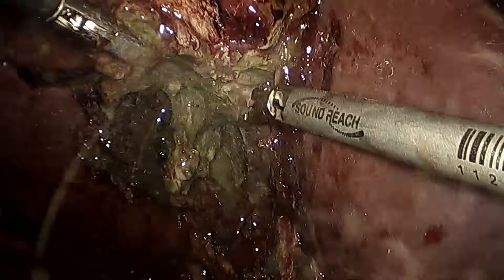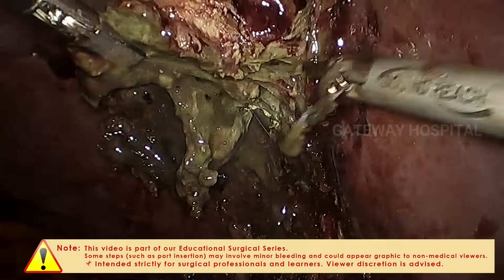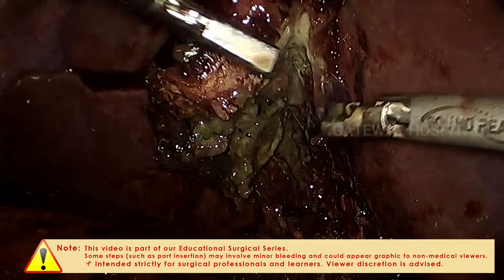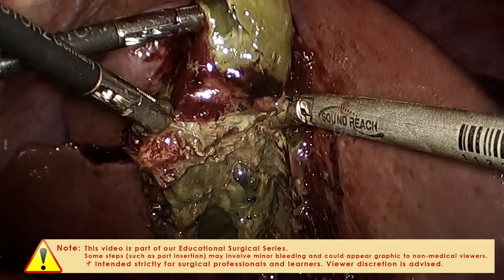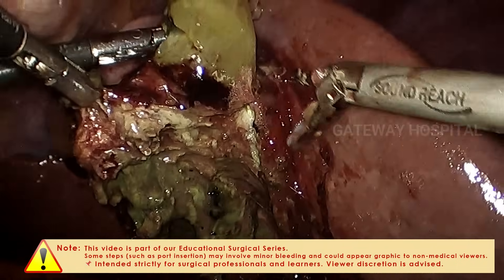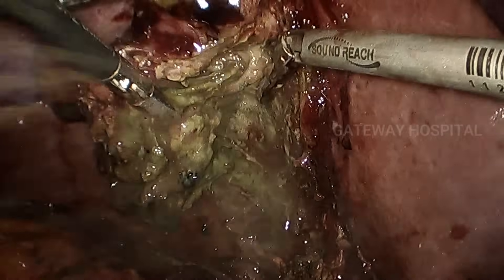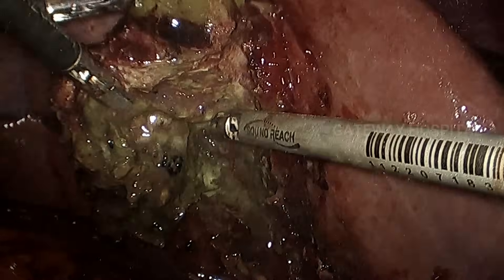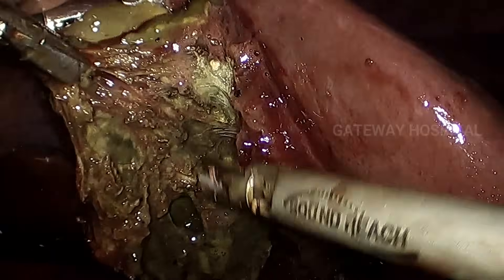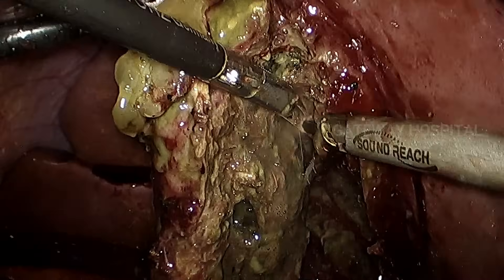Even in these difficult cases we will be able to find a good plane and can easily separate the gallbladder without any bleeding. The remaining steps are similar to standard laparoscopic cholecystectomy with intact gallbladder traction, and we are not losing the cranial traction of the gallbladder. Once the gallbladder is separated, the specimen can be removed by placing it into an endo bag, or sometimes we slice the specimen into multiple longitudinal pieces and extract it through the 10mm port without contaminating the port.